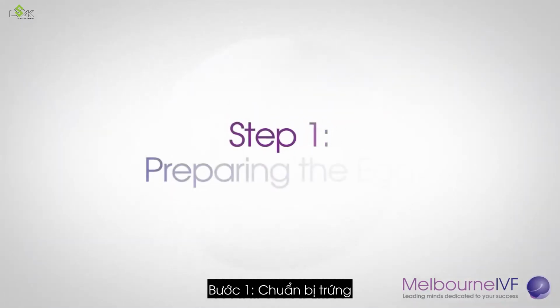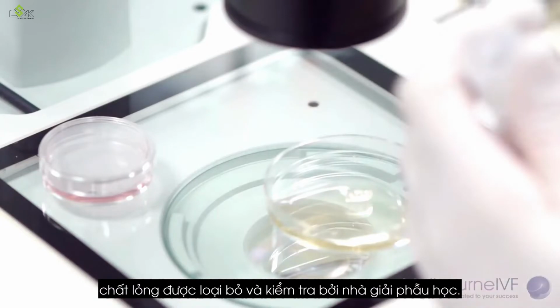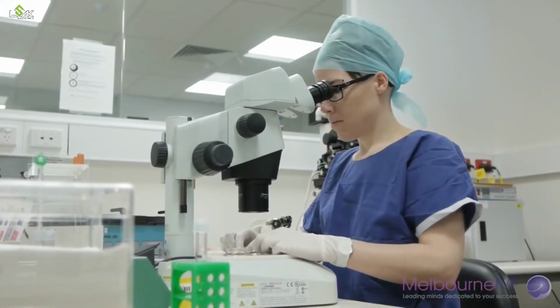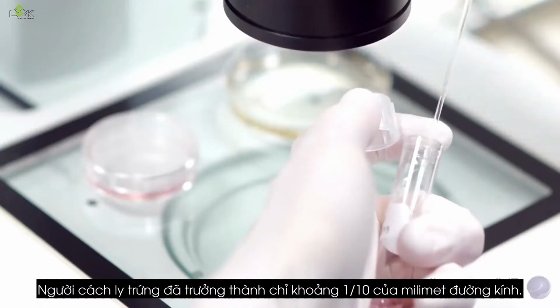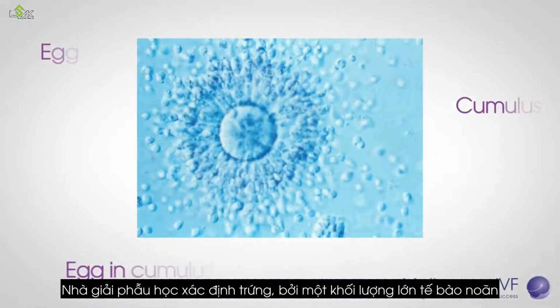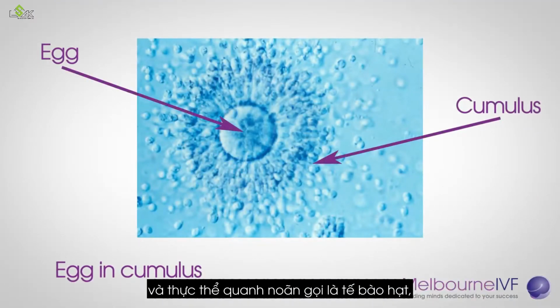Step 1. Preparing the egg. For the egg collection, fluid from the ovary called follicular fluid is removed and examined by the embryologist, who isolates the mature eggs, only about 1/10 of a millimetre in diameter. The embryologist identifies the eggs by a large mass of cells and material called cumulus, which surrounds the egg during ovulation.